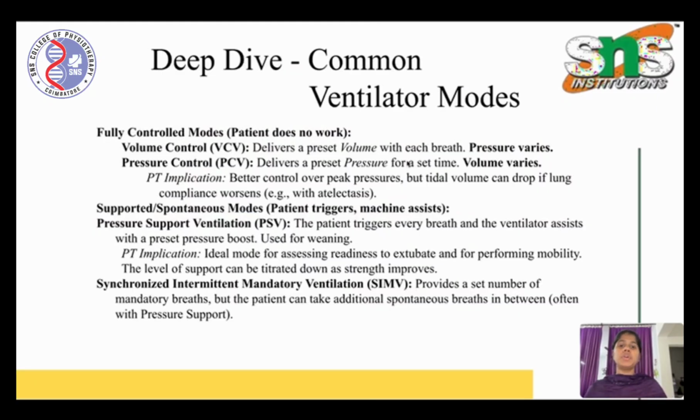So, a deep dive into the concept of common ventilator modes. Fully controlled modes, where the patient does not need to work, include volume control, delivering a preset volume while pressure varies, and pressure control, delivering a preset pressure for a set time while volume varies. These offer control, but tidal volume can drop if the patient's compliance worsens.